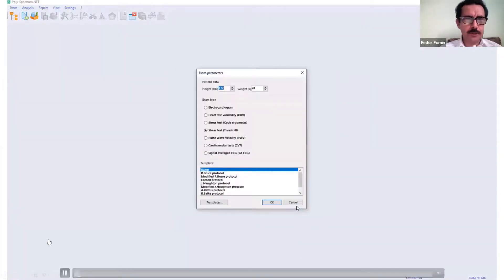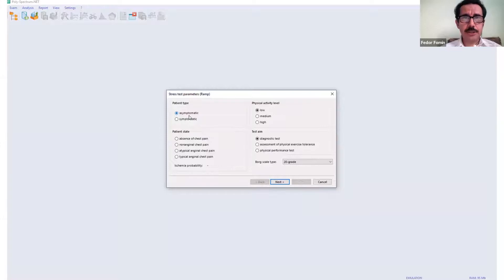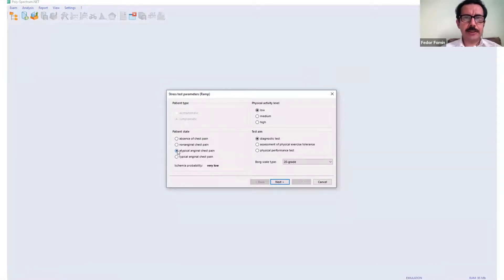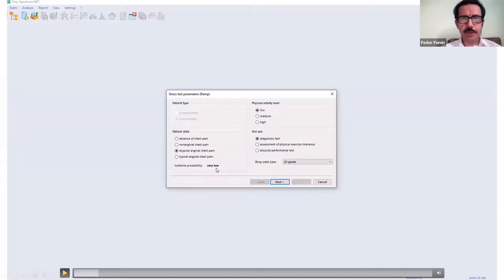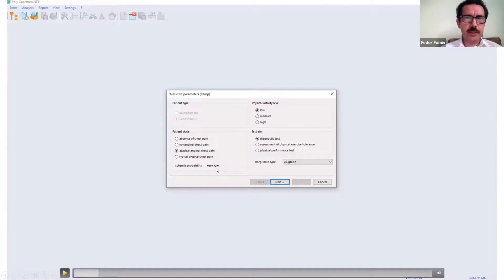Now a short video to show some live work of this software. We have our person in the database and select a template. Here is a short quiz to get the pretest probability of coronary artery disease. When I input the symptoms according to age, sex, and symptoms, I can see a very low ischemia probability for this particular person. This means I cannot expect a positive result — I should expect maybe a false positive — so as a doctor I need to pay more attention to the analysis and my final conclusion.